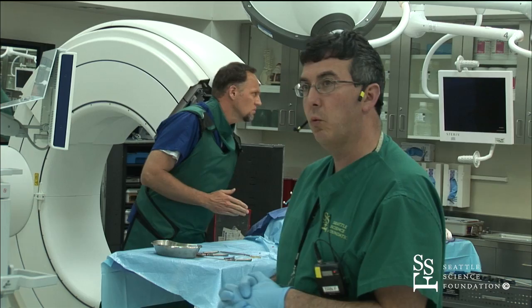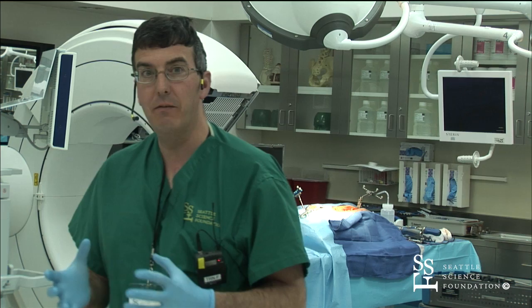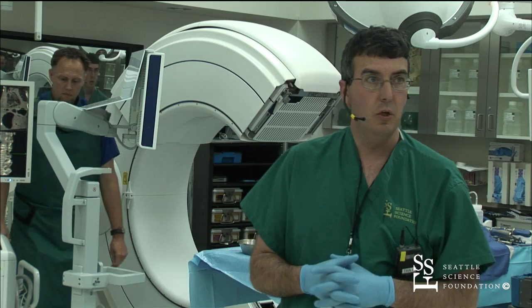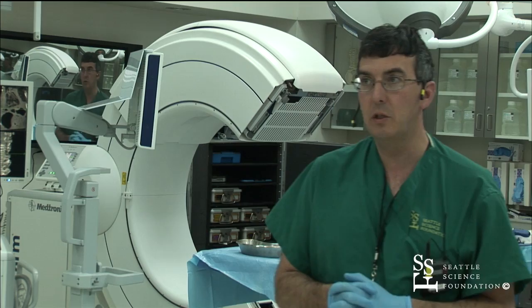So with the O-arm, I found out a couple of things: if you have an O-arm, you have to use it, because you have to have a team and everyone on the team has to use it. There's nothing worse than having an instrument and using it once a year, because when you use it, no one knows how to do everything — it's out of sync and it becomes a disaster. So I usually try to do a navigated case once a week. I do a lot of adult scoliosis and I found it's helpful for that.